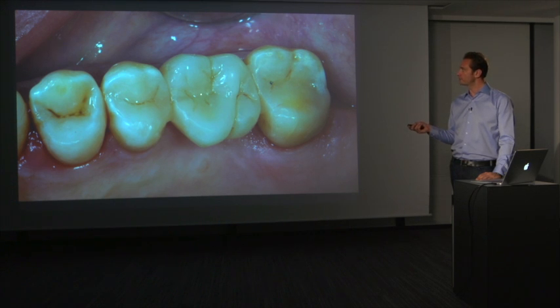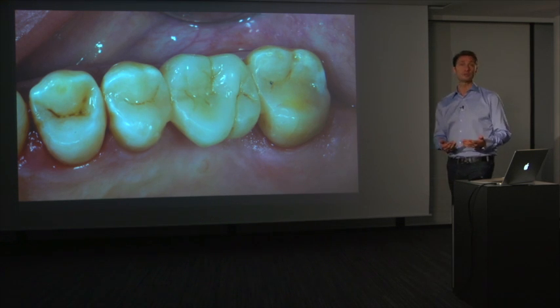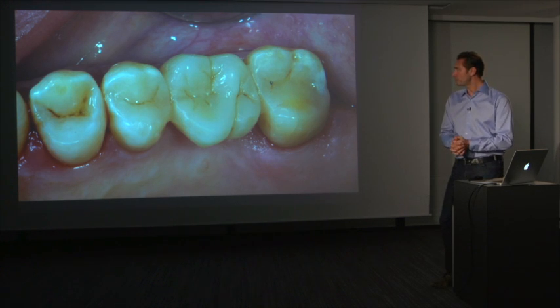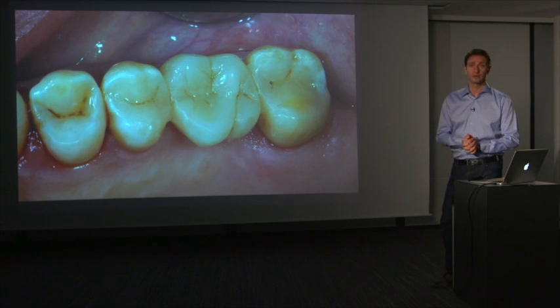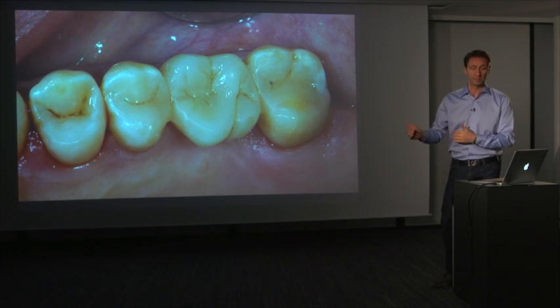And then, of course, because the fiber is going into the inlay part, you have a secure reinforcement of the connector part also. I think we look to a very high longevity for this type of restorations. And as I said, we stretch the envelope and we create new possibilities.